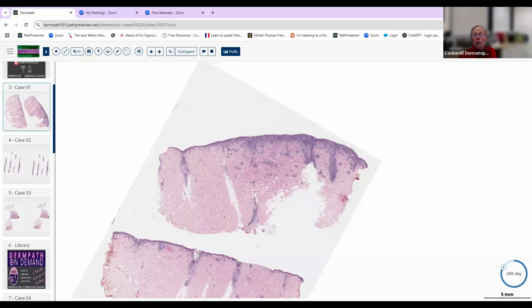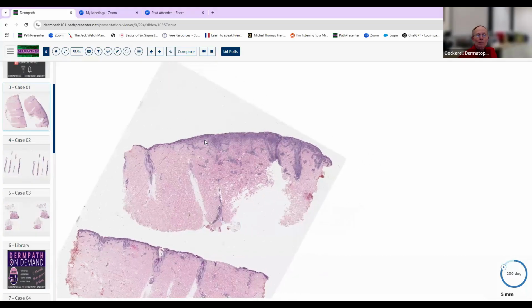And here we've got a very large biopsy, an excisional or an incisional biopsy. So obviously it was a pretty large lesion, and somebody was thinking they needed to do either a large incision to get a representative sample, or they were trying to remove the entire thing. And we think it's inflammatory or neoplastic. Certainly at low power, it looks like most of the cells are small and dark, blue, purple, or black. So there are inflammatory cells in here, and we think it's probably going to be lymphocytic, at least in some way.